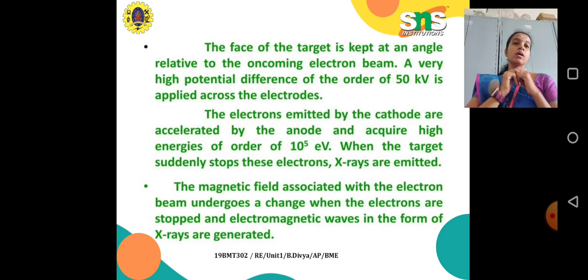When the target suddenly stops these electrons, X-rays are produced.